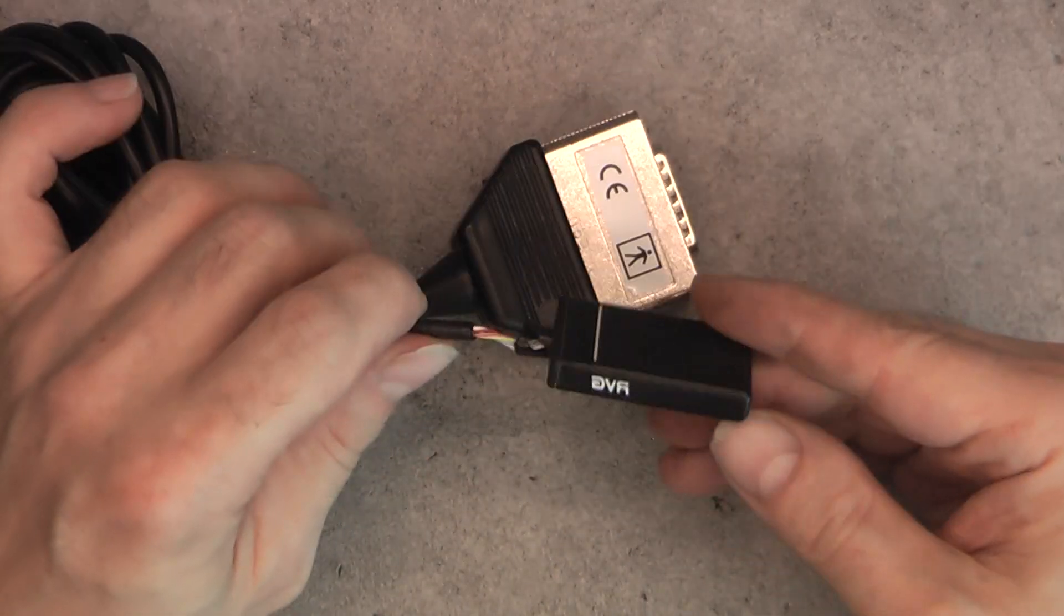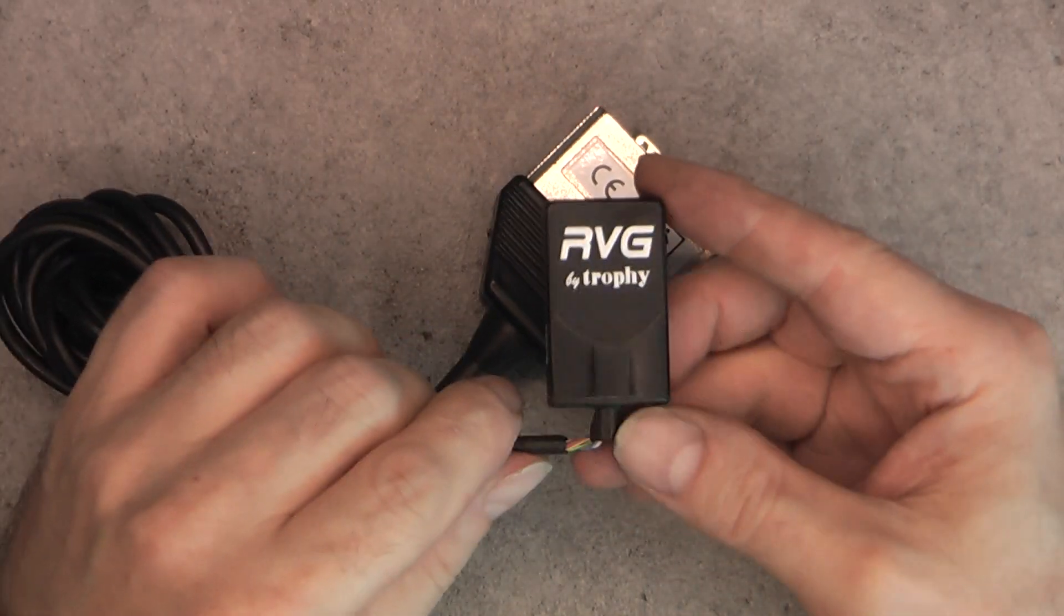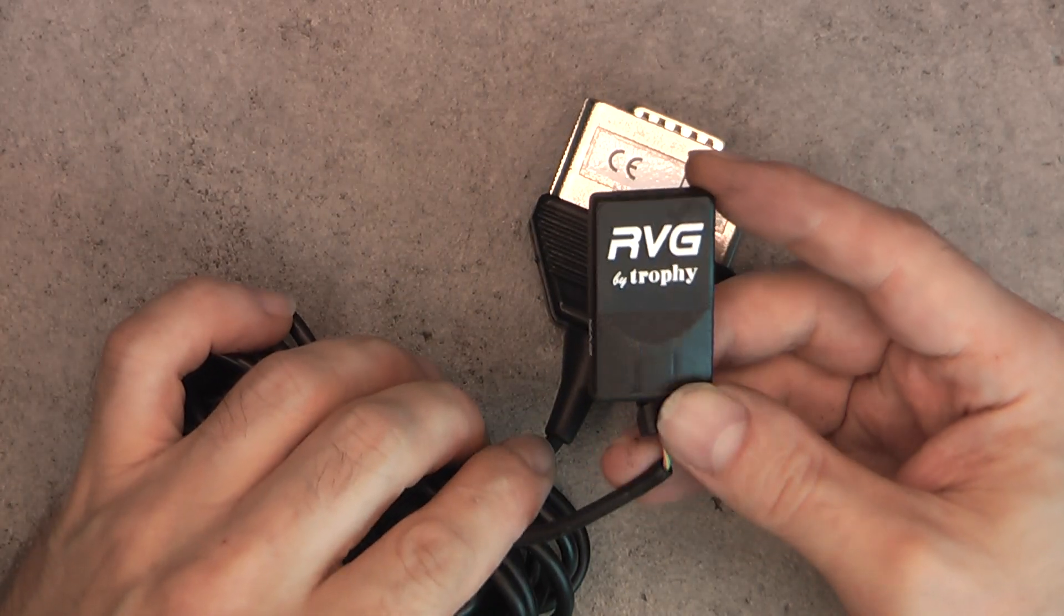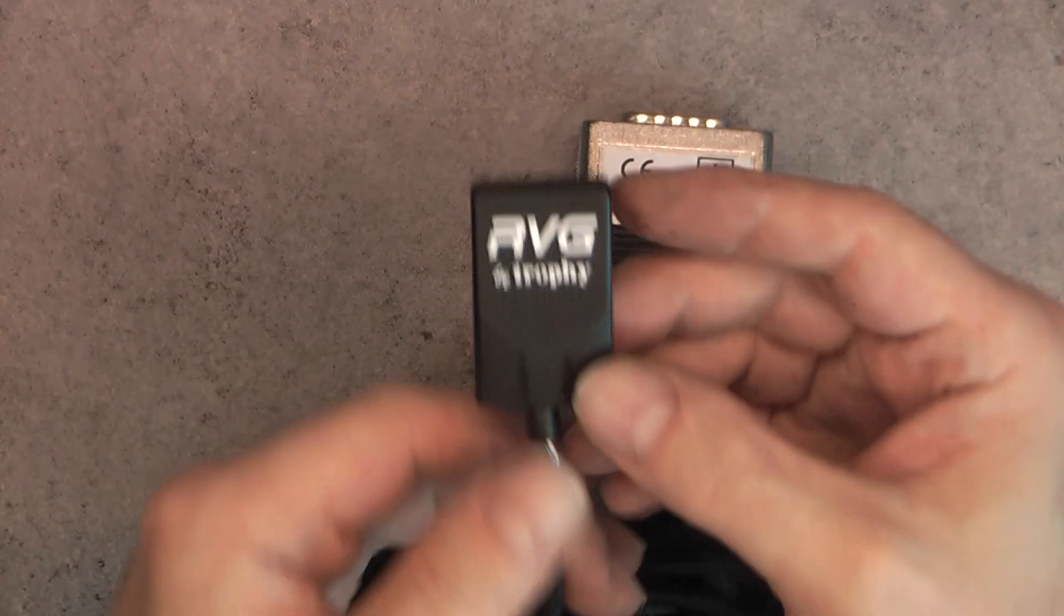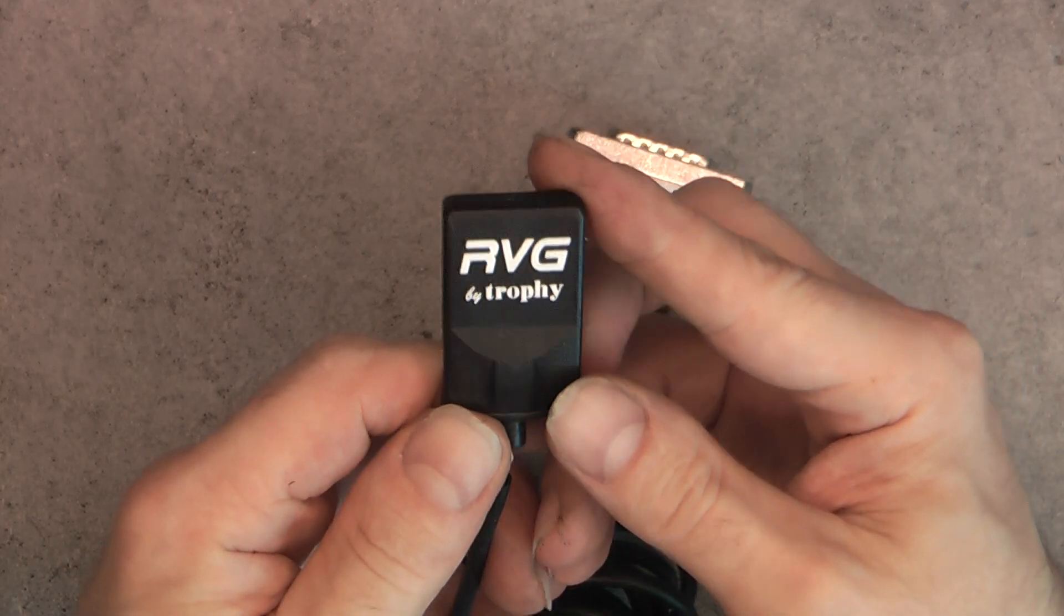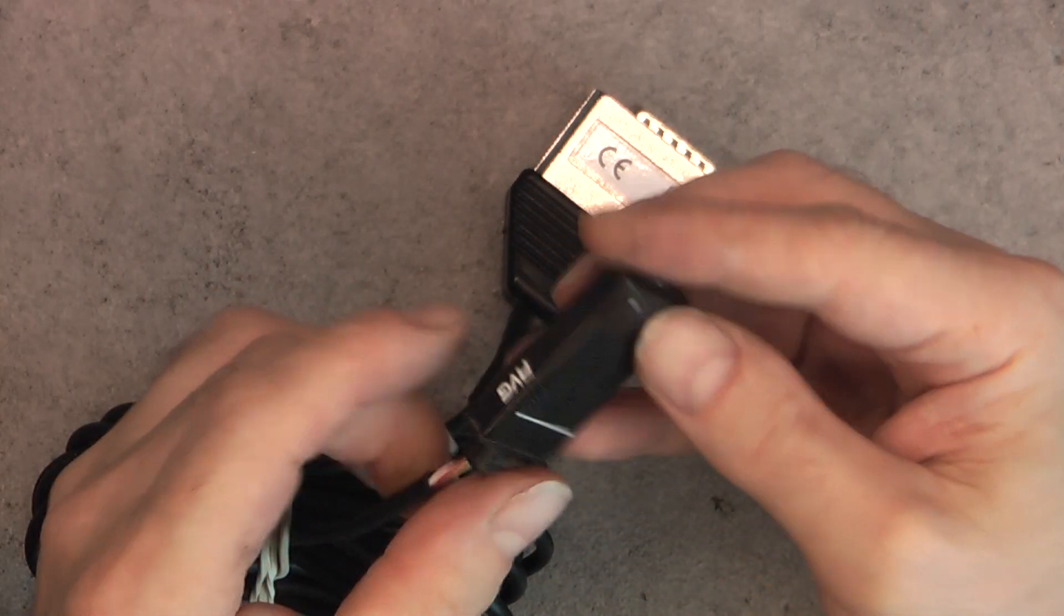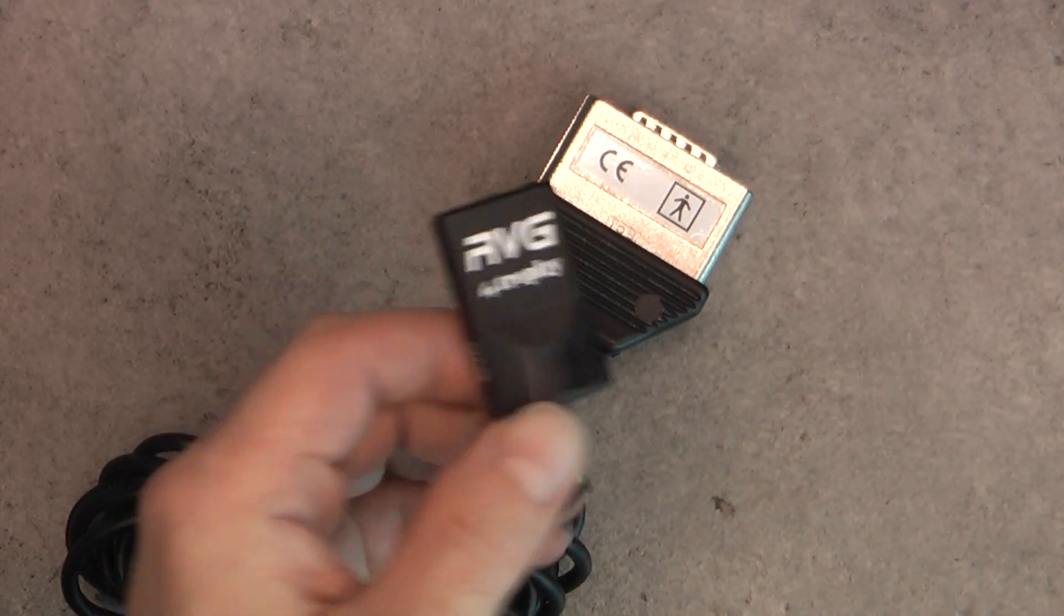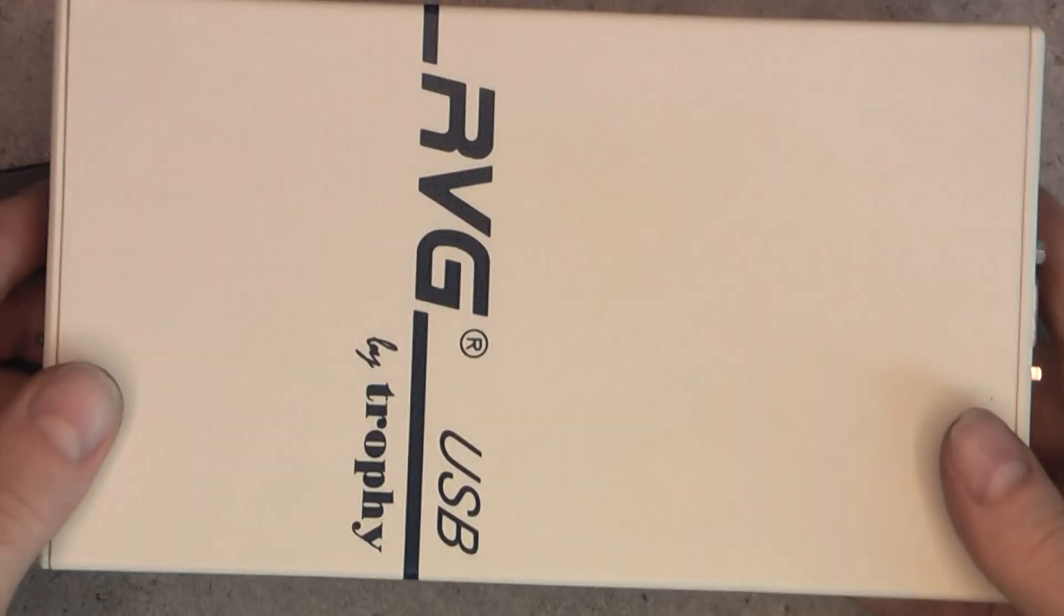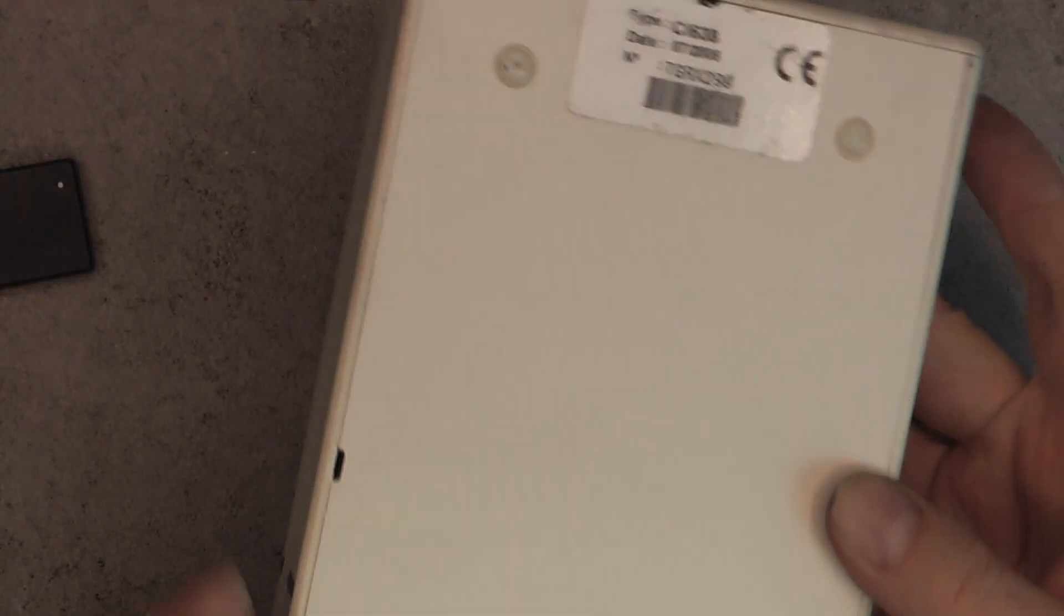For today's teardown, I have one of those dental intraoral radiographic sensors, ARVG or RVG by Trophy, made in France I believe, because the interface box is actually French made.